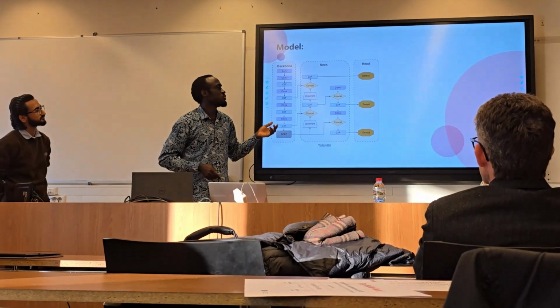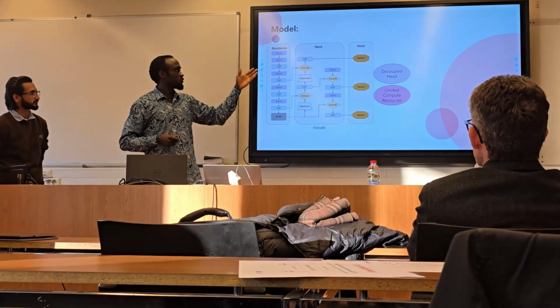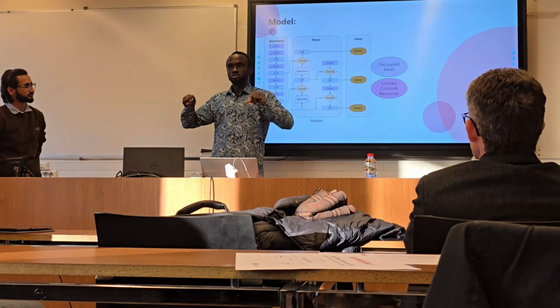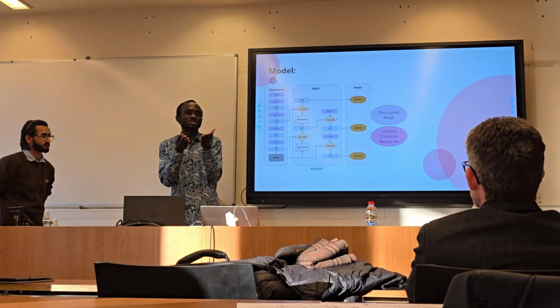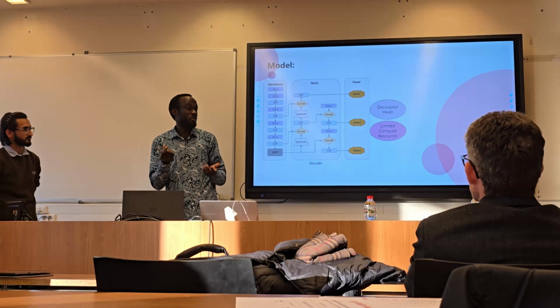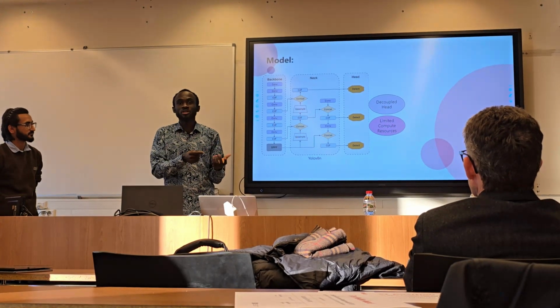With this reason, and because of what is called the decoupled head, finding the lesions in different sizes, we didn't go for YOLO V9 because of the computational resources we have. Our systems can't handle that for long, and YOLO V8 is faster, so we went for the one we can handle.